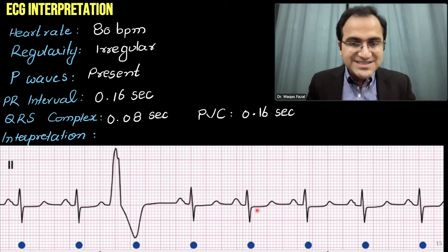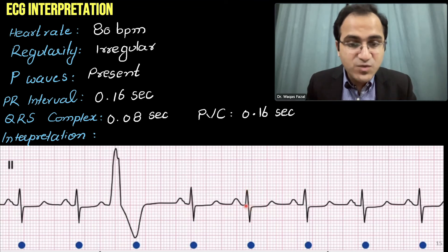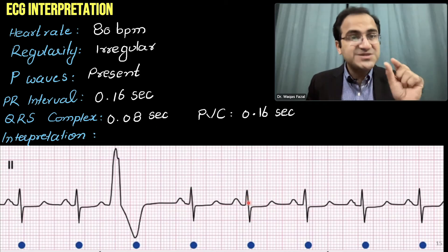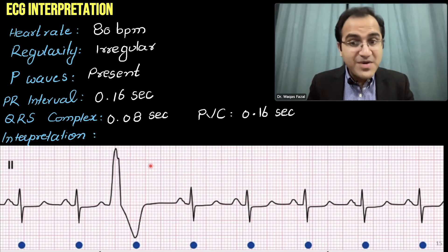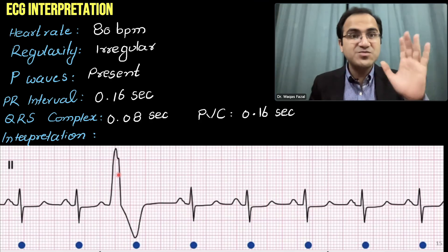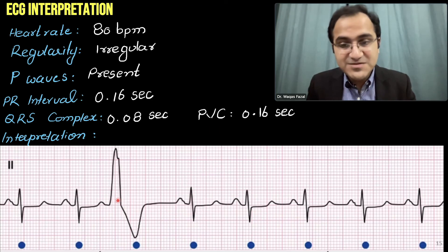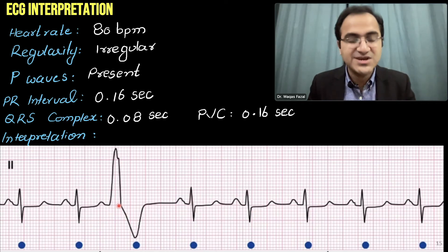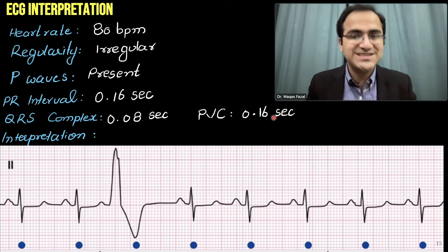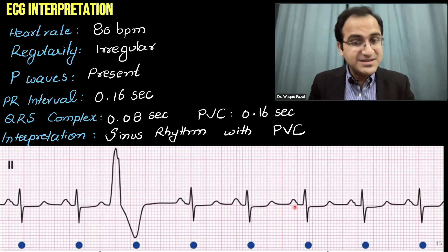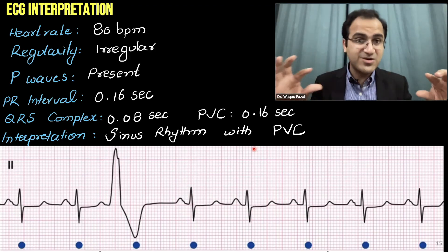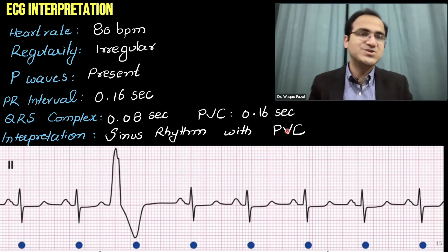There is also an abnormal QRS complex — a PVC — measuring almost four small boxes wide: 4 × 0.04 = 0.16 seconds, confirming a wide QRS complex. The interpretation of this ECG is therefore sinus rhythm with a premature ventricular contraction. The interpretation is not just 'premature ventricular contraction' — it must be stated as 'sinus rhythm with a premature ventricular contraction.'